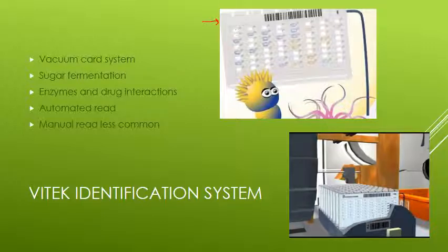And these are basically intended, if you look at this little cartoon over here, this tube has the suspension of your bacteria, whatever your suspected organism is. And you have a small tube going up from the suspension. It's a vacuum tube, basically, into the card. You place this hole, and you can put as many cards on this carrier here as you need, okay?